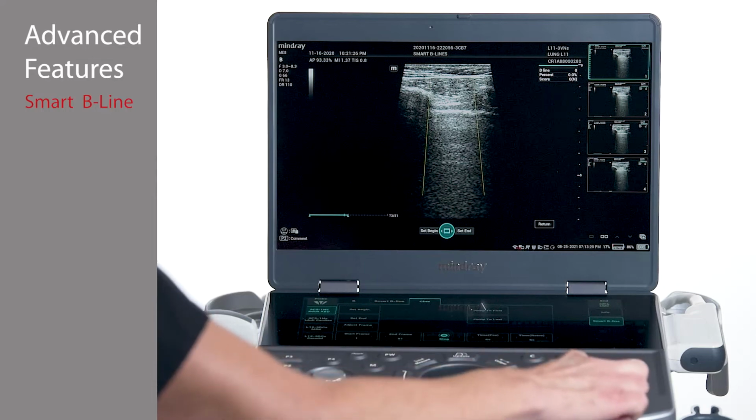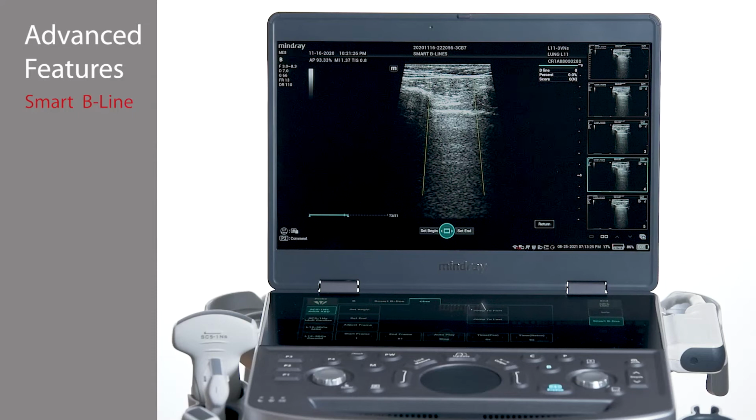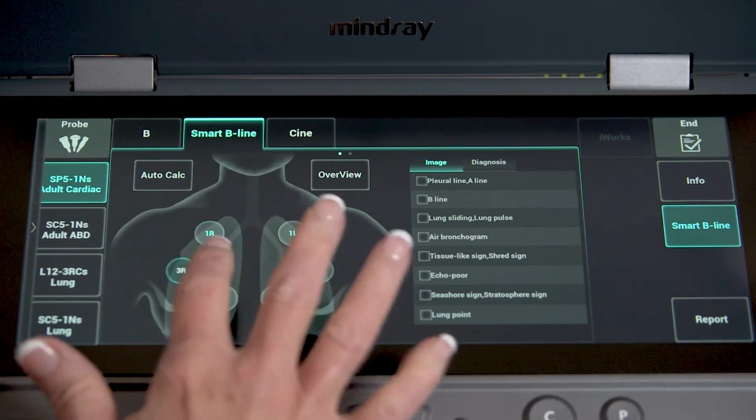The system automatically detects the rib acoustic shadow, analyzes and calculates the B-line number, distance, percentage, score, and also automatically displays the image with the largest percentage. Repeat for all lung zones.